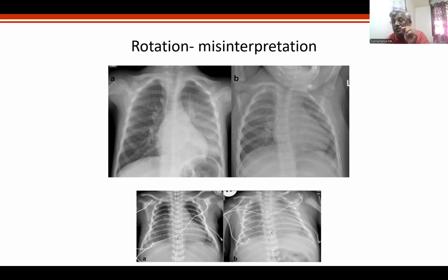You got the point. The advantage of a CT scan over a chest X-ray is that it defeats all these points, because there is an inbuilt software which is going to interpret an image in this way, in this way, in this way. 4 to 5,000 images around will be computed, and it depends on the generation and slice. I think you have heard of spiral CT, this type of CT.